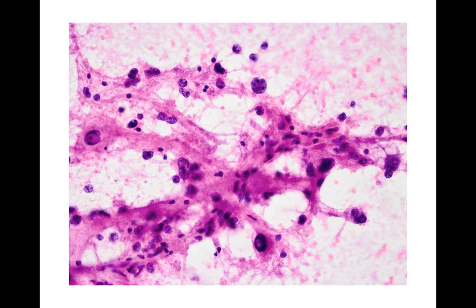case I showed you. But the tumor, if this really is a tumor, did not contrast enhance very well. There was very little white. That makes me wonder, geez, could it be something else? The other thing is, just looking at these cells, they were so bizarre and so atypical. They were so out there. I've actually seen cases of viral diseases, for example, viral encephalitis, that can produce cells that look exactly like this.